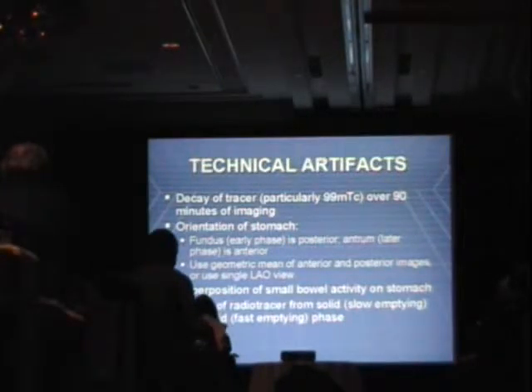And what we do, we basically give the patient a little bit of radiolabeled food. In our case, it's going to be a whole egg, scrambled egg, with some sulfur colloid in it. And the patient eats that, and then we image the stomach for 90 minutes and see how much of that empties and how much of it stays in there.